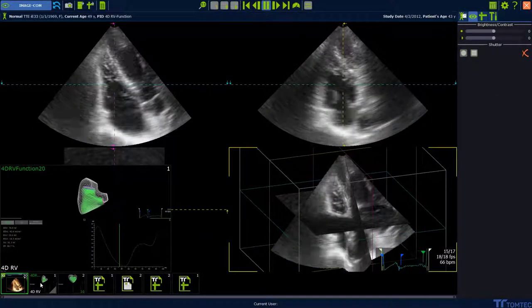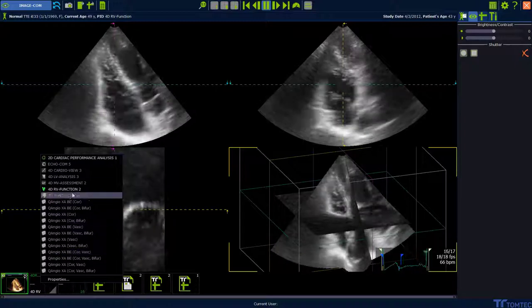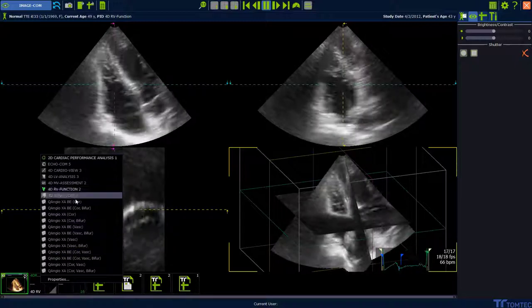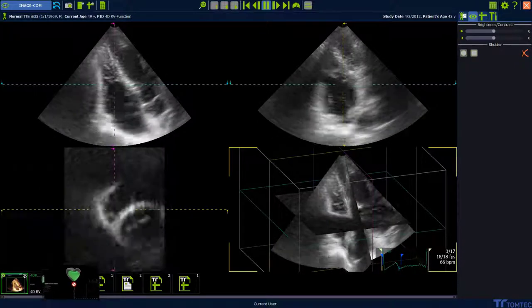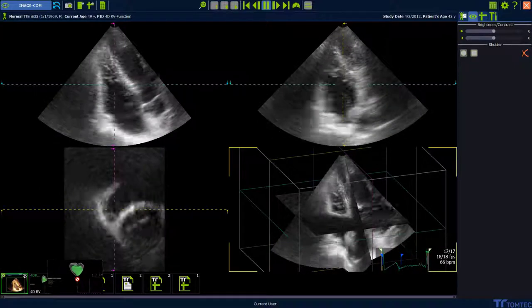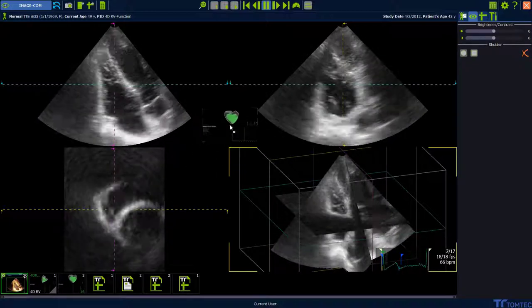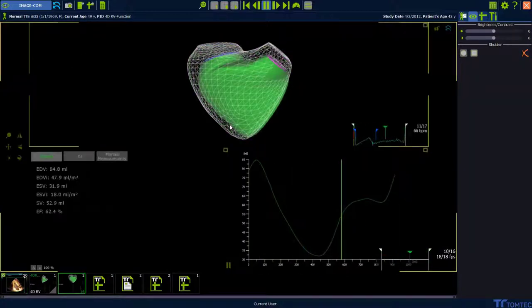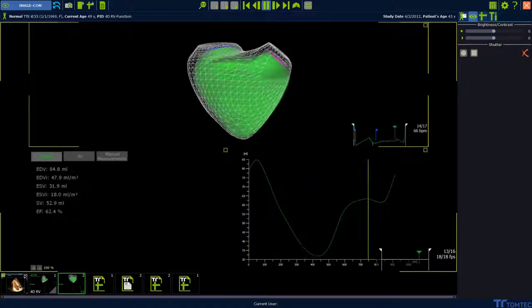In the thumbnail list next to the right, we can see the bookmark. Right mouse click on the bookmark to relaunch. And next to the right, you can see our secondary capture. Drag and drop to visualize.